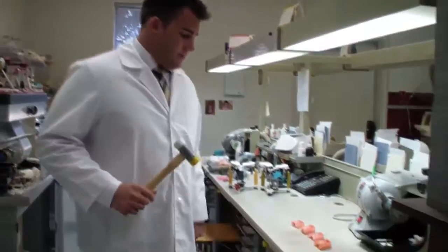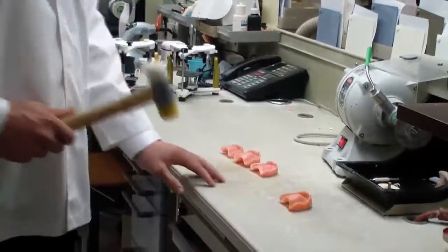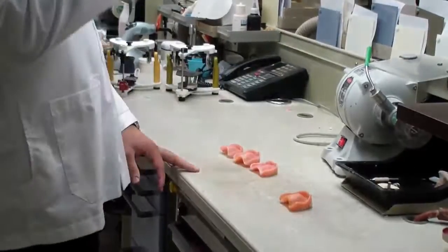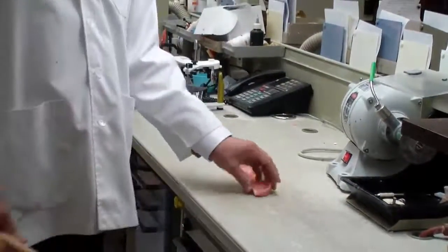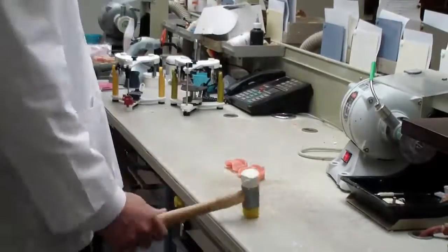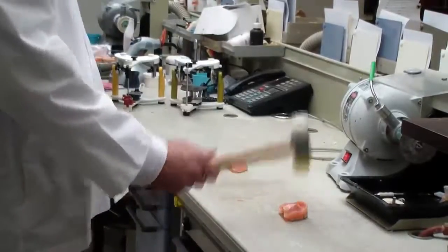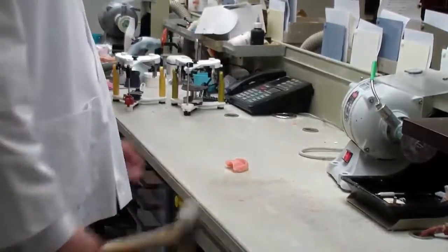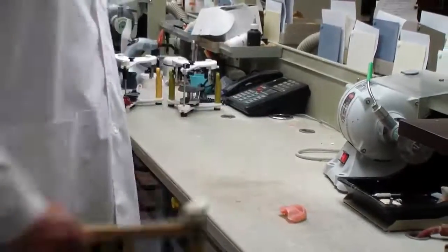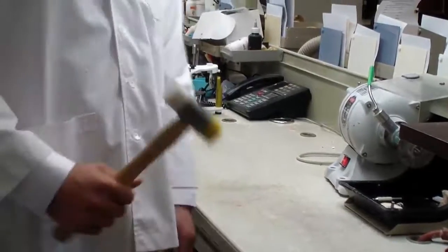So now we're going to begin our testing with the non-reinforced press-packed dentures. Looks like that one went in one shot. Two for two. Three for three. Good thing I don't got to clean up.